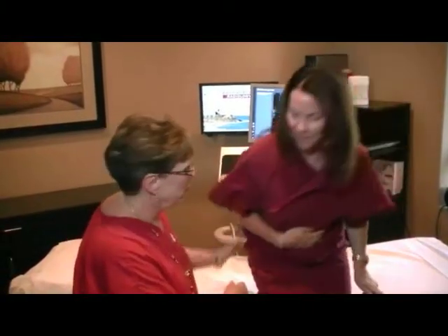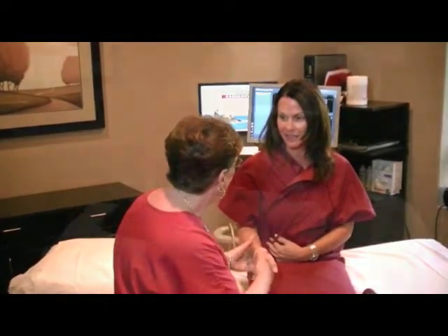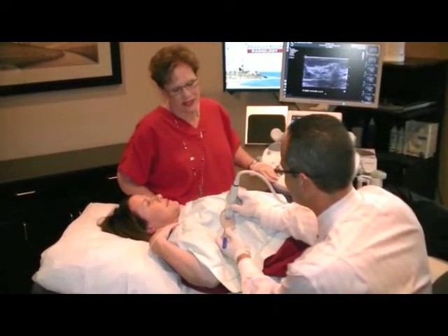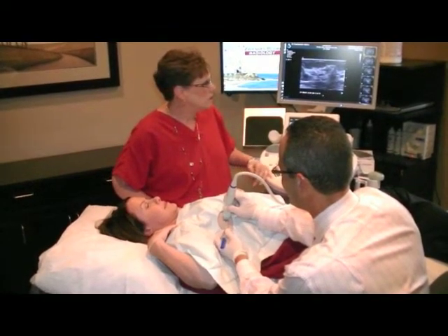The sonographer assisting me during the procedure will perform a limited ultrasound examination targeting the region of concern and will take some pictures. Some marks with an ink pen may also be placed upon the breast skin surface. I will also be imaging the area before we get started.